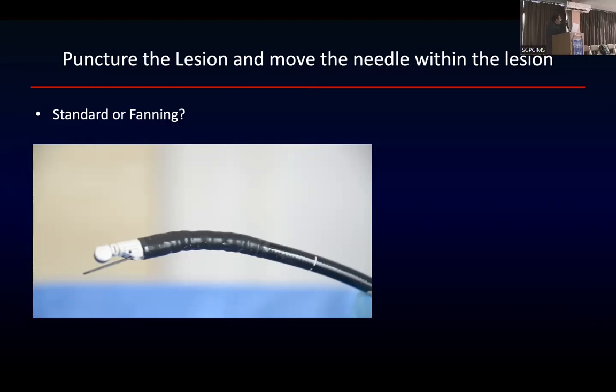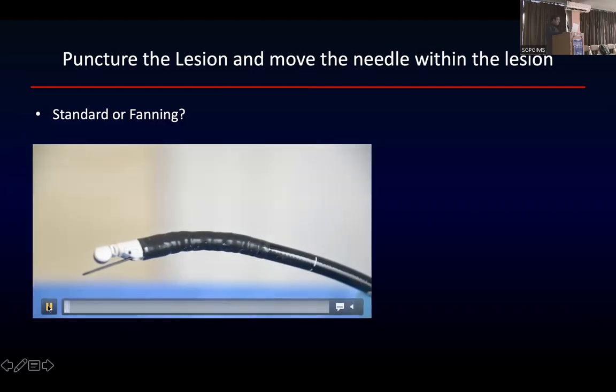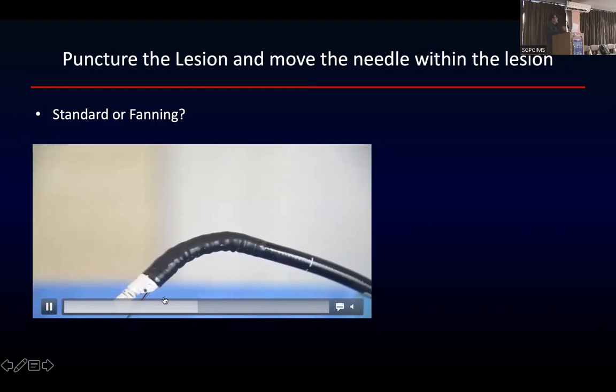But what needs to be done is fanning. This is more applicable for an FNA. Now, since we are gradually shifting to FNB in majority of the cases, fanning again is needed, but you do not need to fan the whole lesion. Fanning क्या कर रहे हैं आप? Fanning basically आप क्या कर रहे हैं? जब आप lesion के अंदर पहुंच गए, तो आप इस needle tip को एक बार ले गए, to and fro movements की, फिर आपने इसका position adjust कर दी.